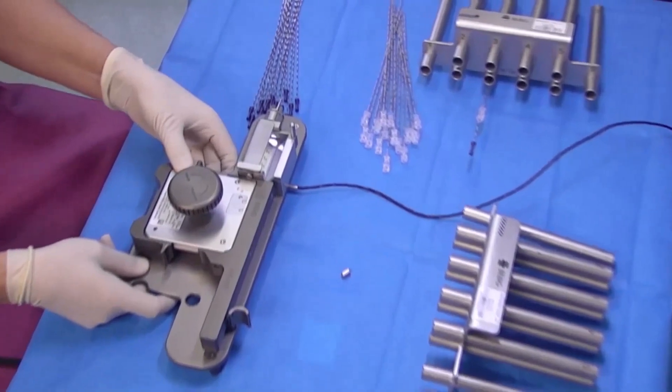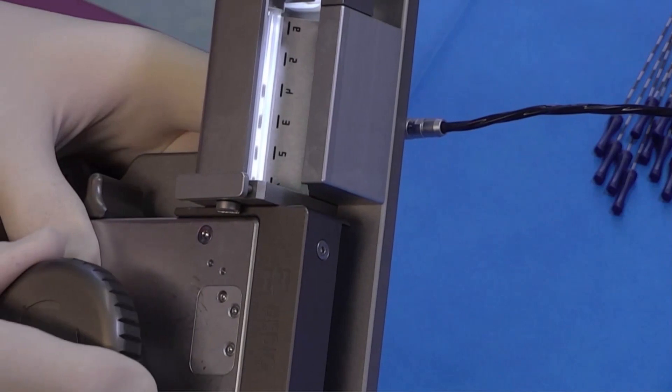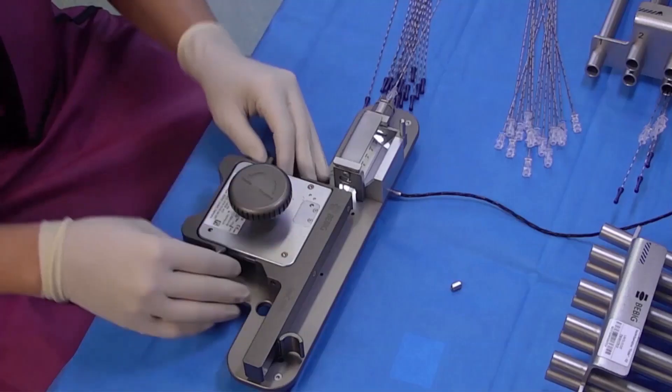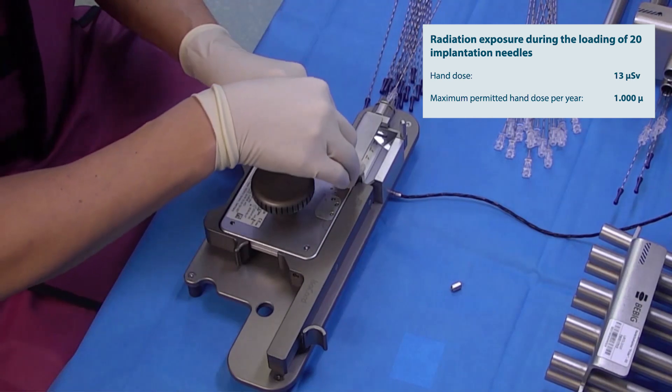According to the treatment plan, seed chains, which are linked seeds, are then prepared and transferred into implantation needles. The radiation exposure of the medical staff during this step is low.